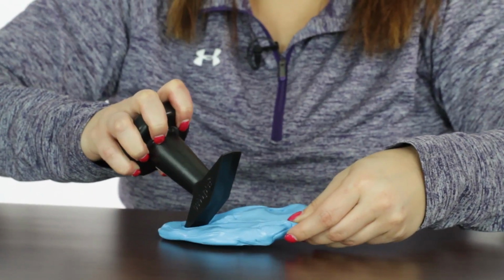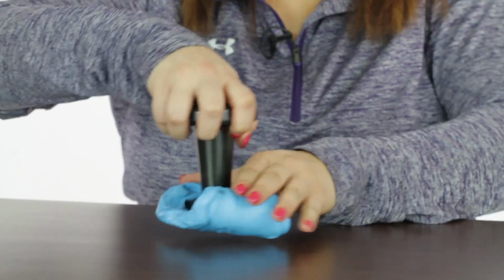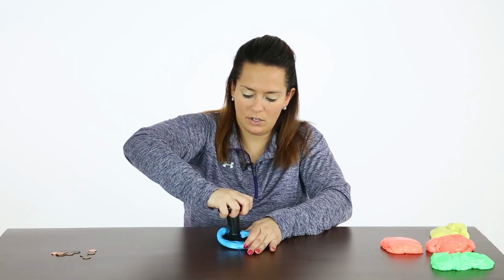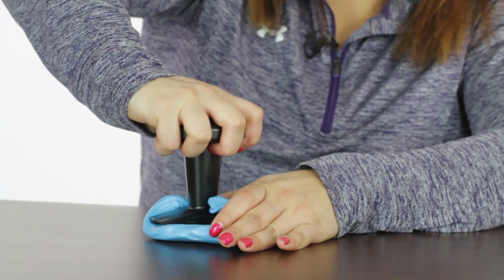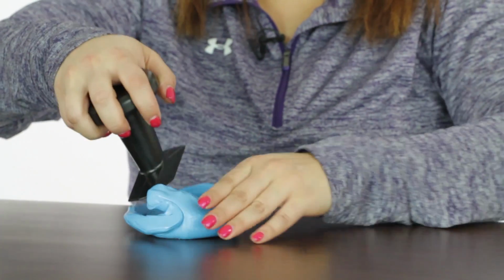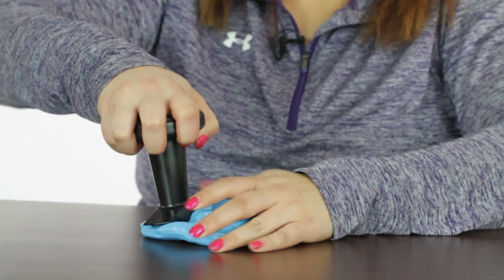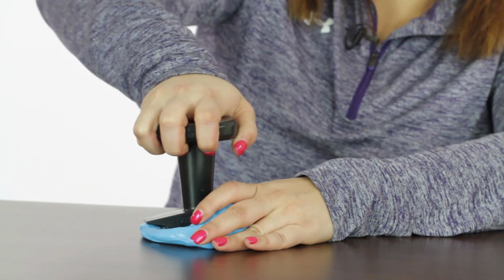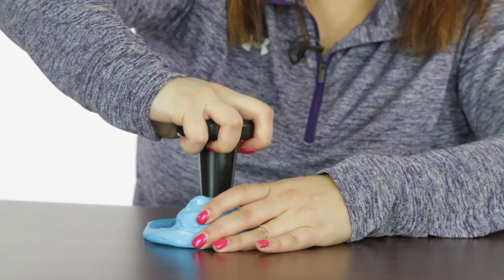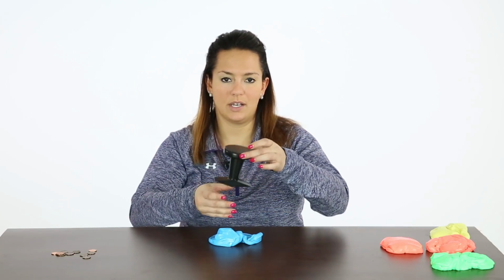So I'm going to hide this portion, stabilize it, and again using all my fingers for this turn to really push it down in there and rotate it. So opening or closing anything large, a doorknob, peanut butter jar, a jar of pickles, anything that would require a gross hand strength. And that is the putty size knob turner.